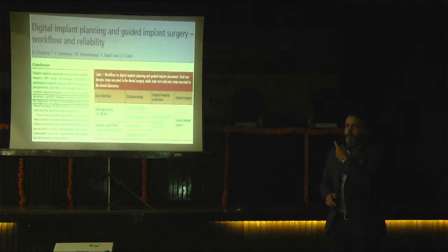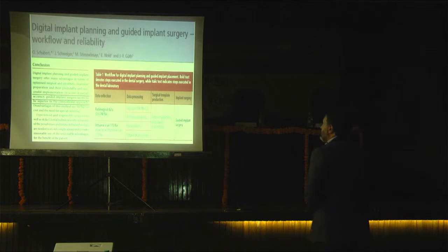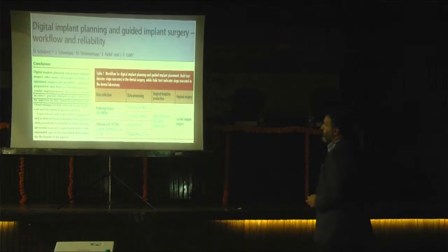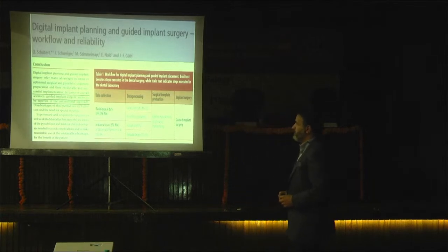So there are so many scientific papers on this topic, and the first paper I found is Digital Implant Planning and Guided Implant Surgery: Workflow and Reliability. Digital implant planning and guided implant surgery offer many advantages in terms of optimized surgical and prosthetic treatment.